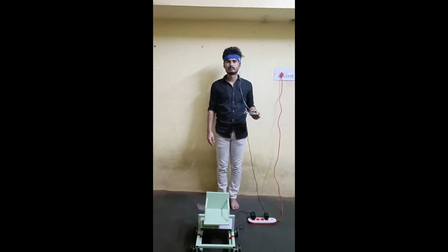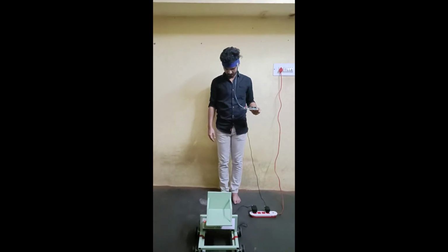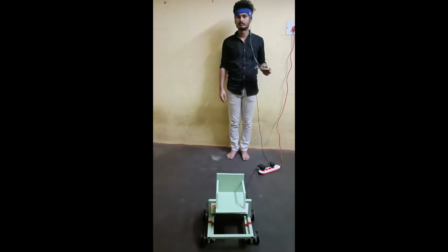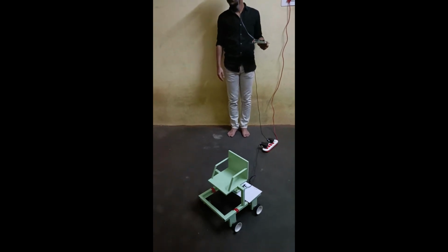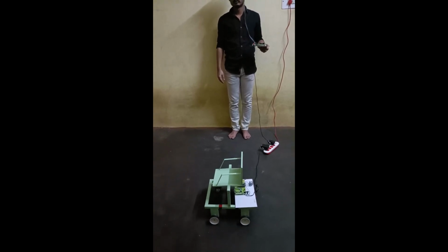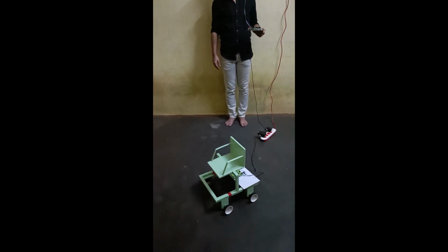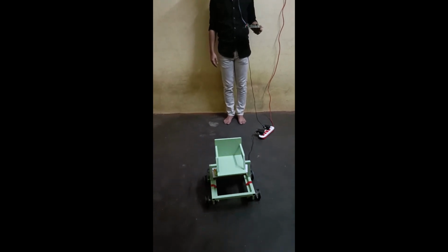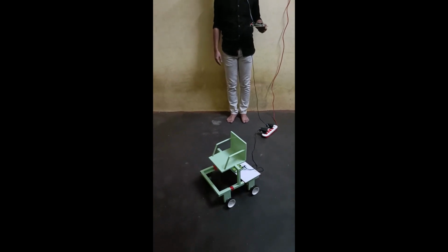Now he is going to tilt his head forward, and the wheelchair is going to move forward. The wheelchair is moving forward, and whenever he turns right, it is going to turn right. Now the wheelchair is turning right according to the data received from the accelerometer. Now he is going to turn left, and the wheelchair turns left according to the data. The left data will be 4 and the right side data will be 3. Now he is going to turn right, so the wheelchair is going right.